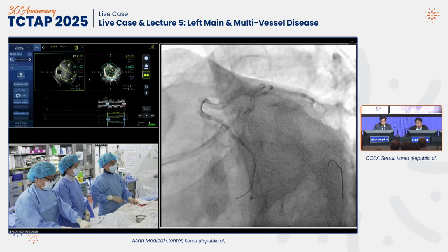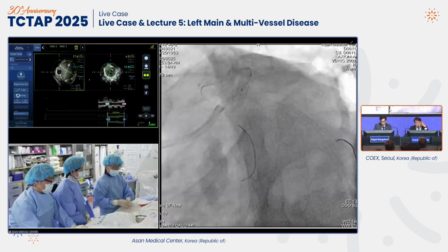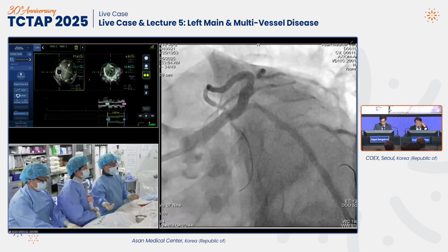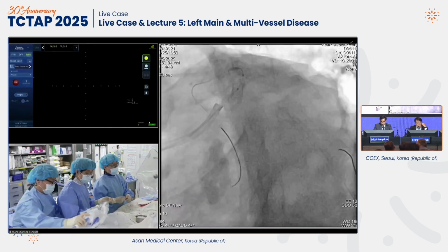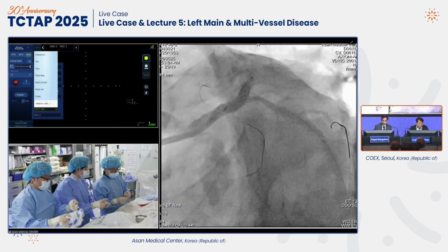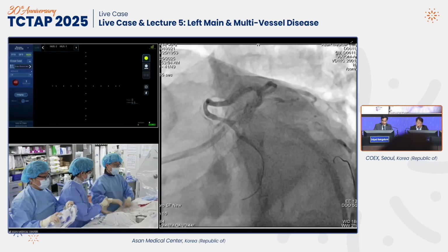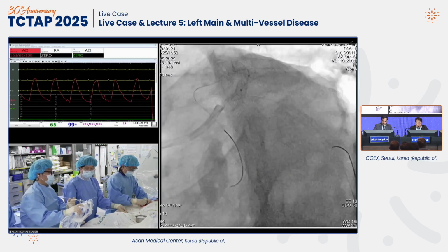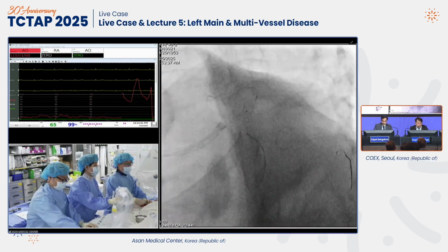Okay. So, what is the next step? And I think for the audience there would be some interesting findings. IVUS, I'm going to check it. Okay, IVUS. So at this moment, I very aggressively applied the NC balloon 3.5 up to 20 ATM. Still 6 or 7 square millimeter, large residual stenosis. I'm going to do an evaluation. So I think at this moment we're going to apply the DCB.